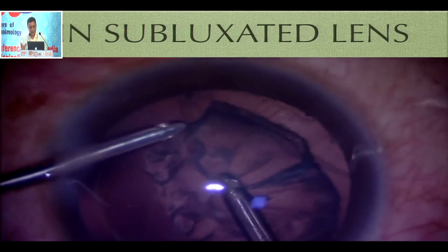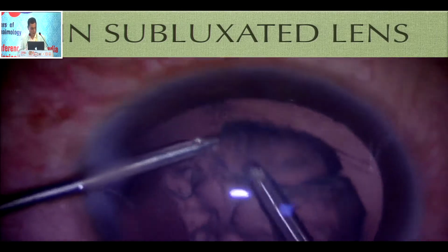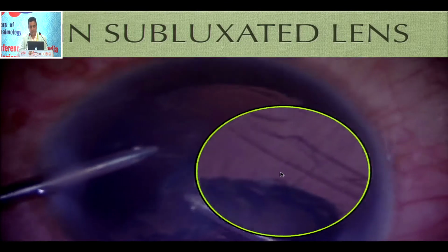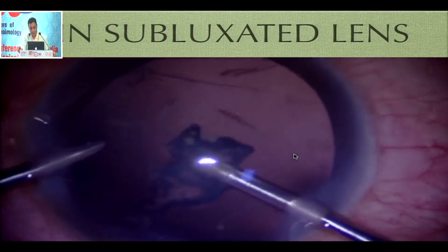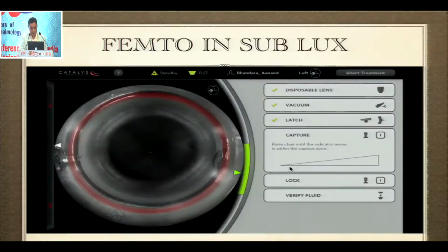So when there is traction, the posterior capsule tries to follow the cortex. Can you see that? So inferiorly you can see the posterior capsule. This is the posterior capsule here, okay? And the cortex is trying to be stripped off, and when that happens, but this is fine because the rest of the zonules are very, very strong, really nothing to worry. I go ahead and then put an endocapsular ring.